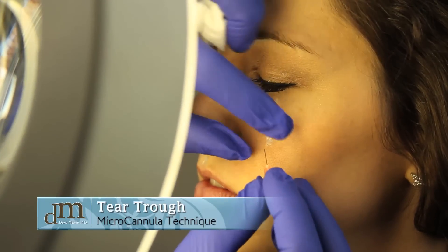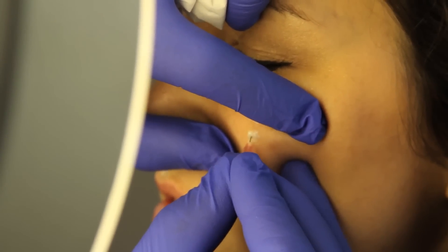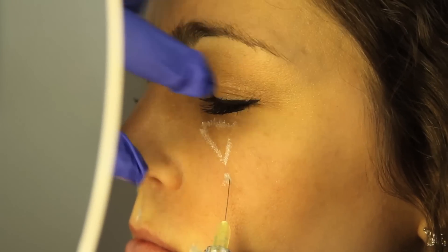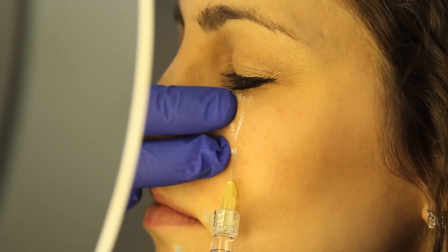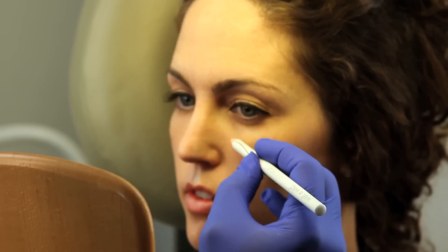We're going to poke far away down here, so you'll feel a little poke here. And then we take the micro cannula. Before, when we finished, we had several needle marks, but I was able to actually treat this entire area through just this one poke.